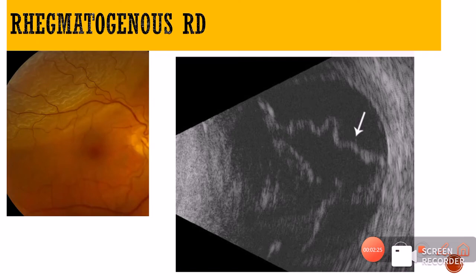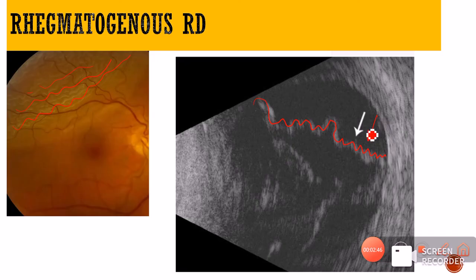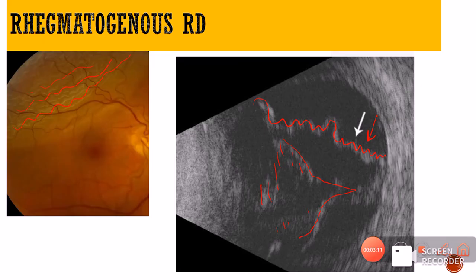Now let us look at the regmatogenous RD — an RD which happens after a tear. On fundus image, we can see the corrugated appearance of a regmatogenous RD. Similarly, on B-scan, we can see the folded appearance of the separated retina — this is the regmatogenous RD. In one case, there is a PVD with reflections in the vitreous — this patient had long-standing vitreous hemorrhage causing traction, resulting in a combined RD with both a traction component and a regmatogenous component.